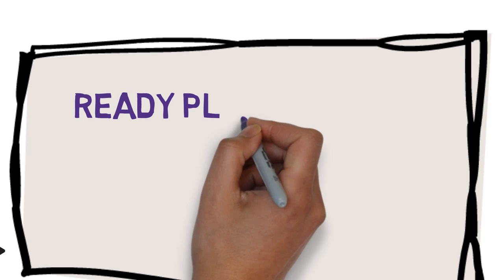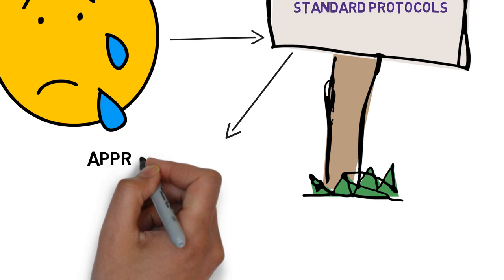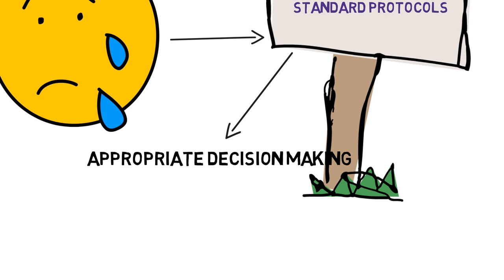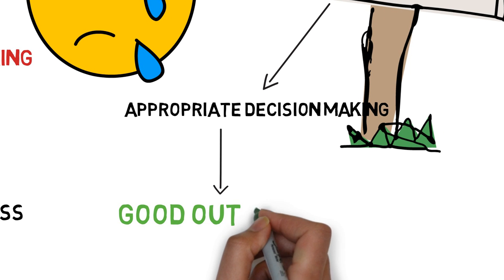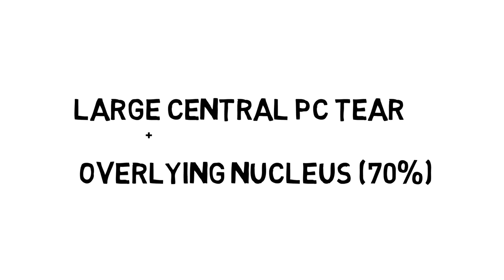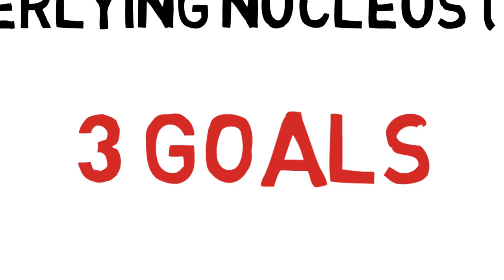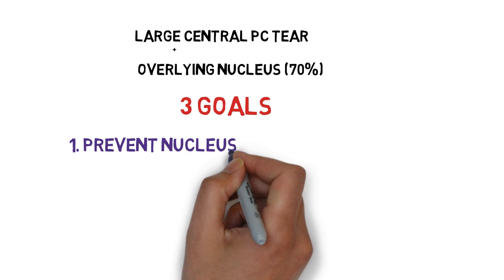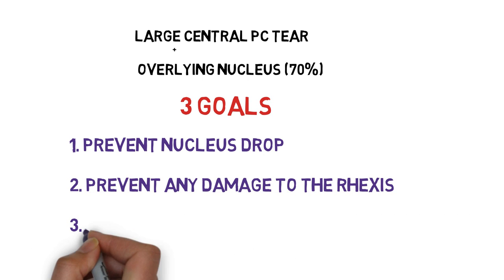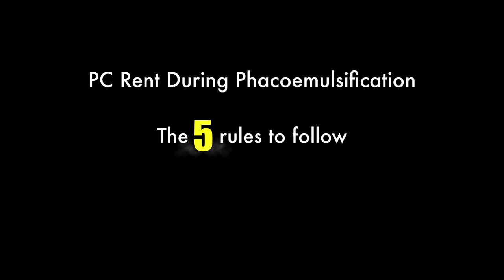In this particular case, we could have had a nucleus drop. In such situations, we must always have a game plan ready with standardized protocols to face these unexpected challenges. Being prepared makes us more confident and we are not relying purely on instincts. In this case we have a large central PC tear with an overlying nucleus, and there are three goals: prevent nucleus drop, protect the rhexis to have support to place the lens, and prevent corneal endothelial damage.